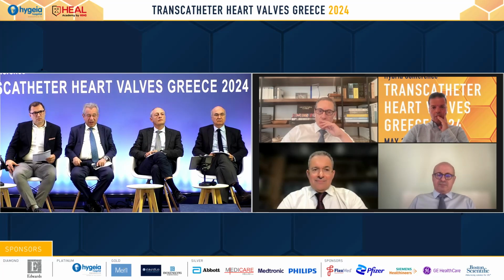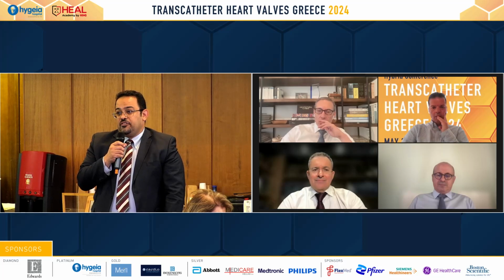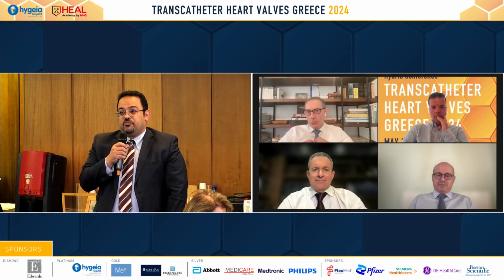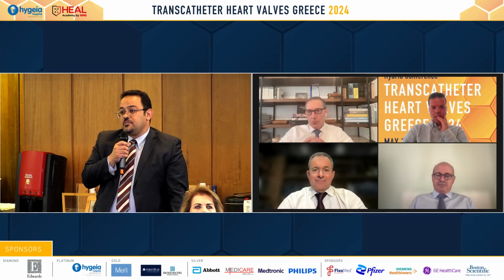So for the mitral valve TEER, I would say 2D and 3D should be enough data. I never used CT for such a procedure. I don't know if anyone on the panel has a different experience.